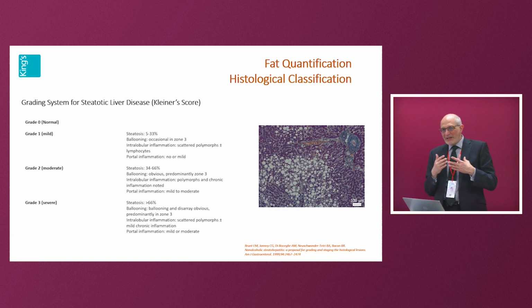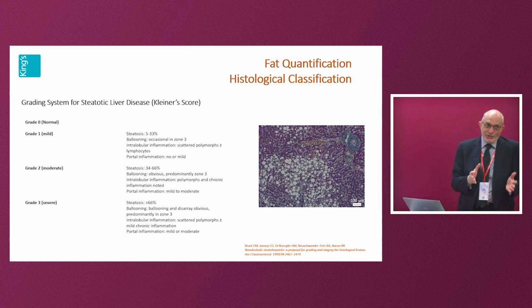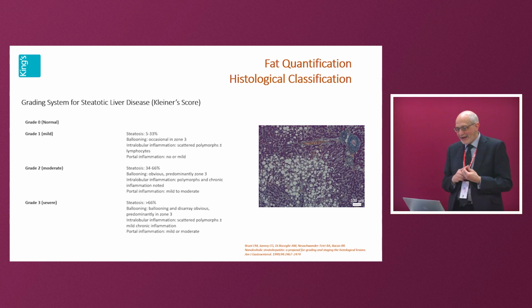So when you think of it, you've got someone estimating for you how much percentage of fat there is. And this, we think, is the gold standard. So clearly it is not the gold standard and will not survive as the gold standard. But whenever you do research and publish something, you relate this to the gold standard. So up till now, biopsy is being considered the gold standard for measuring your fat quantification. But there is a better gold standard than this, and this is what we use in research projects, and this is MRI, but we'll come on to this.